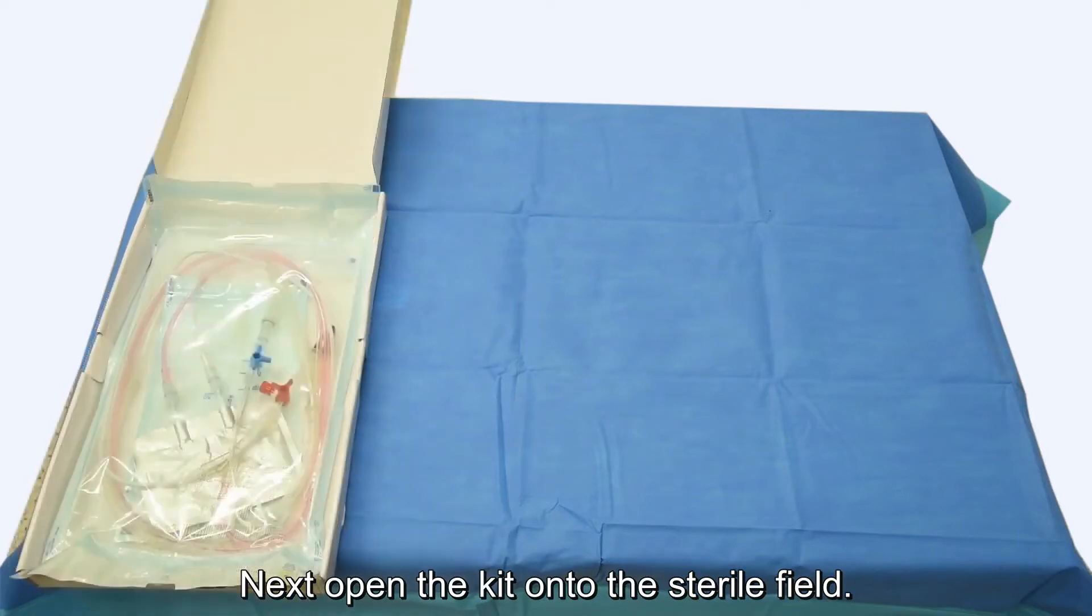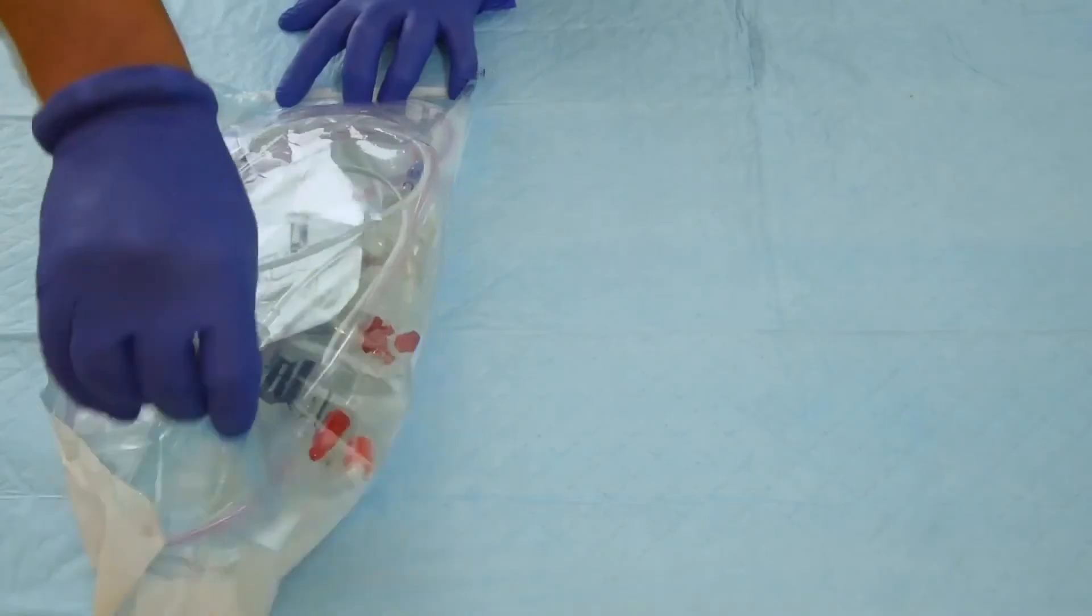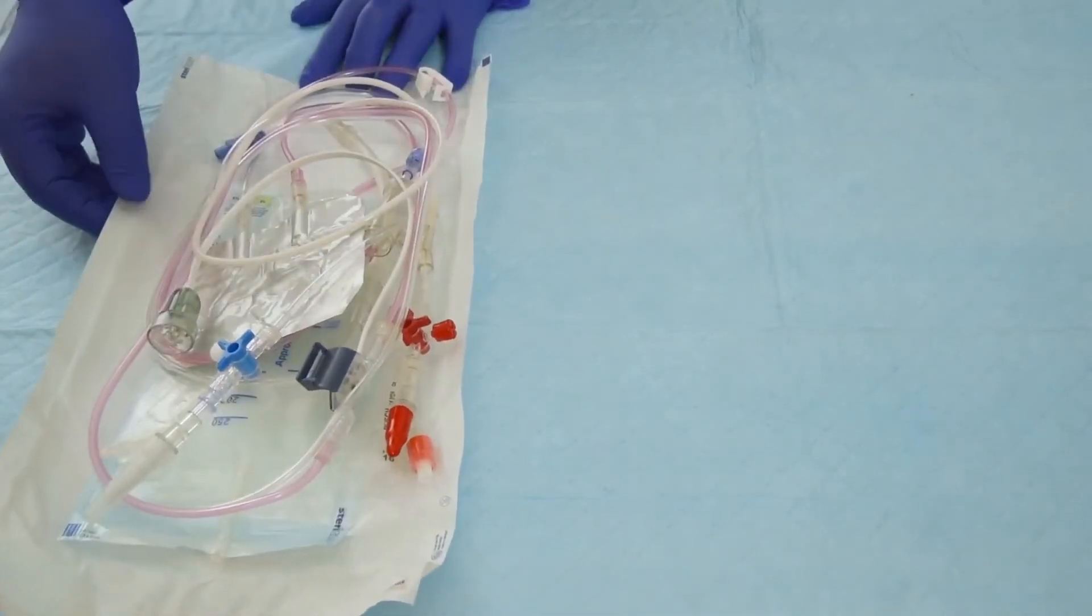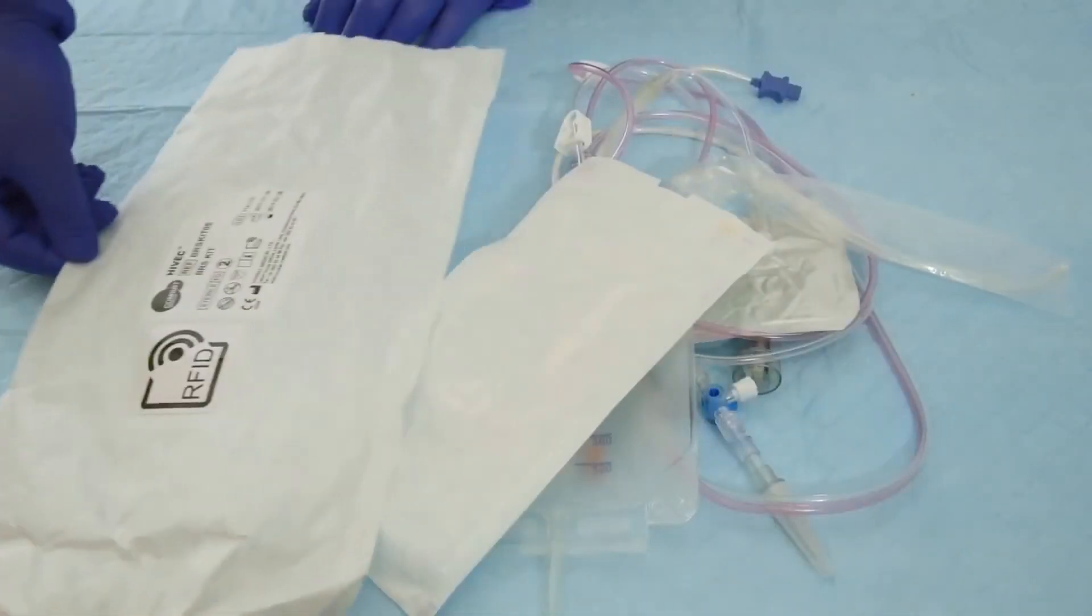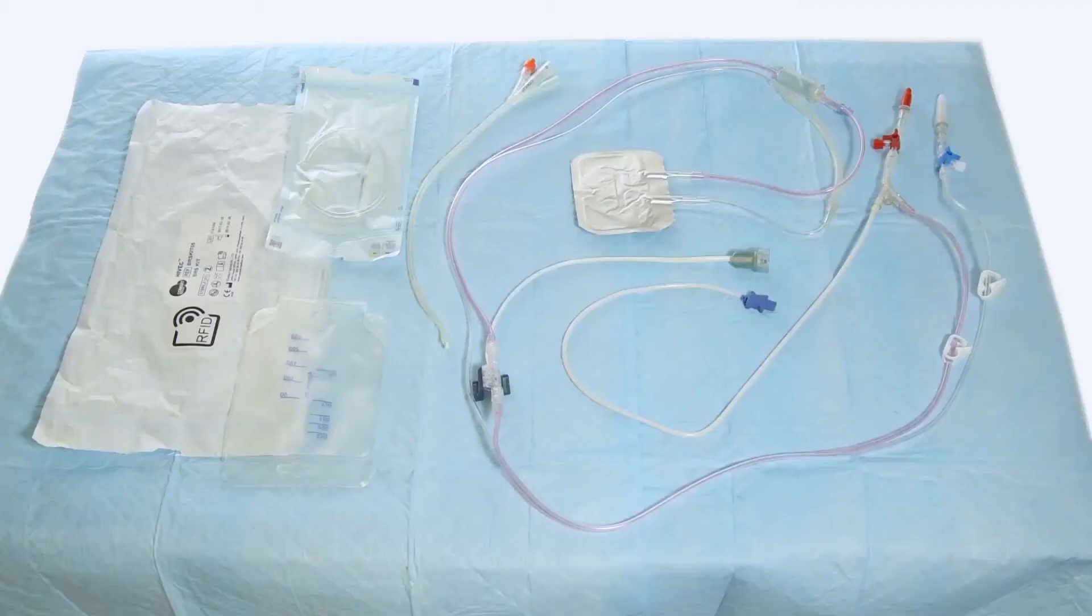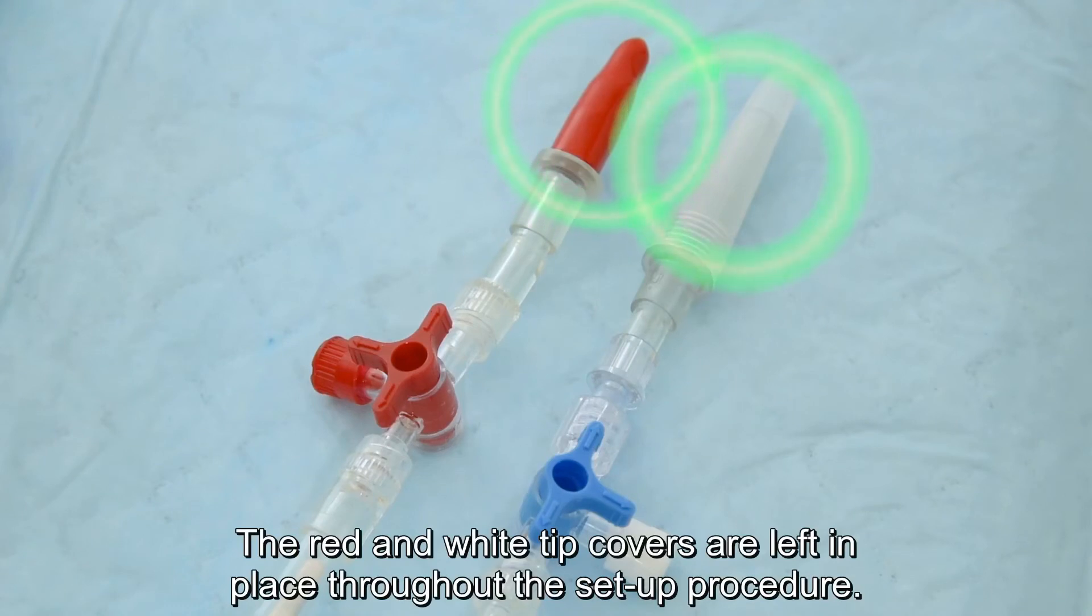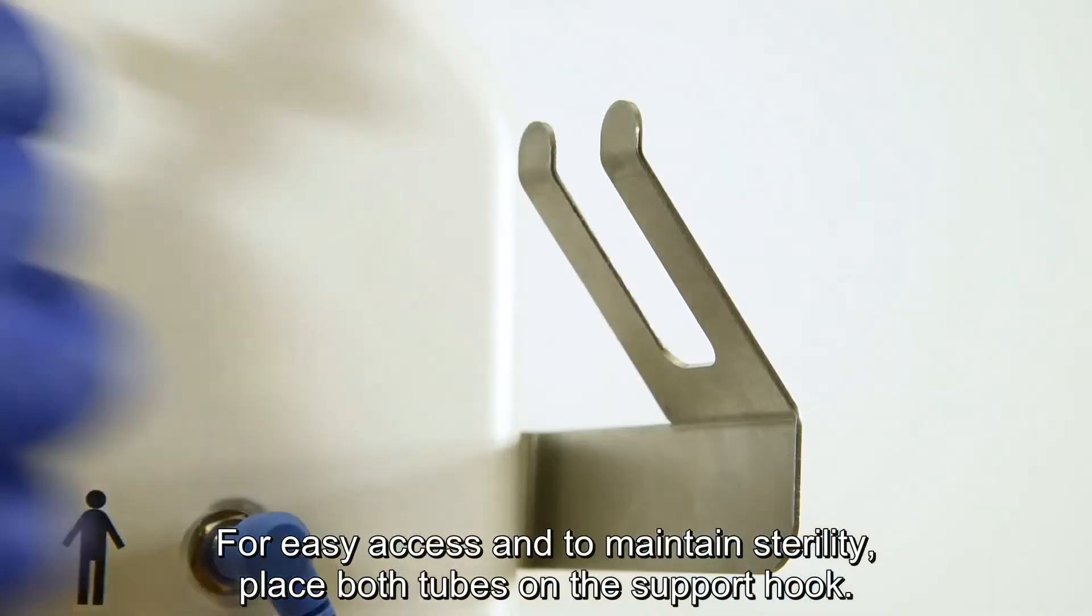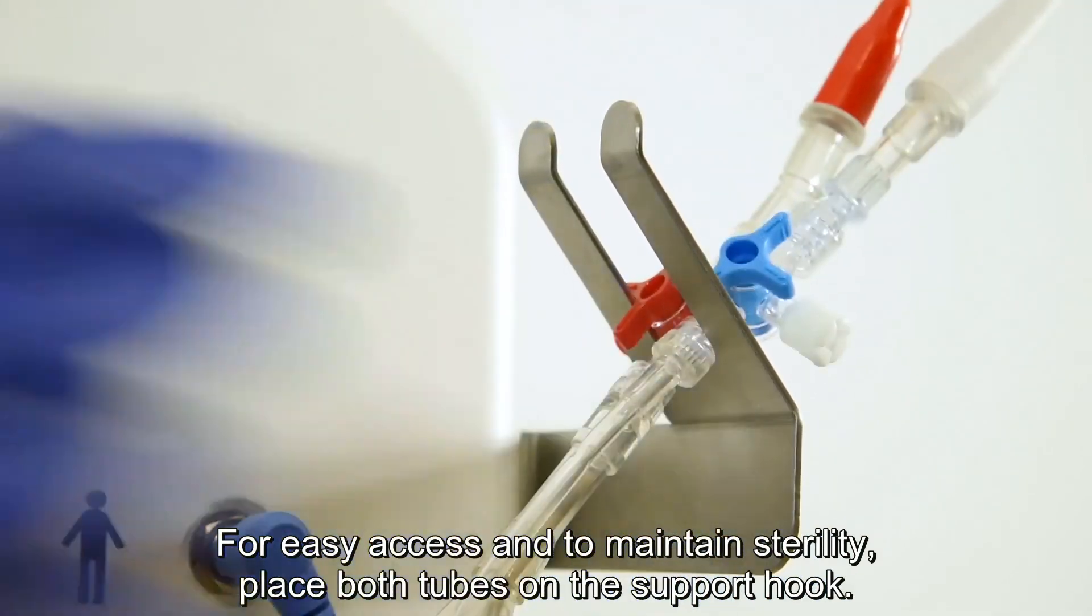Next, open the kit onto the sterile field. The red and white tip covers are left in place throughout the set-up procedure. For easy access and to maintain sterility, place both tubes on the support hook.